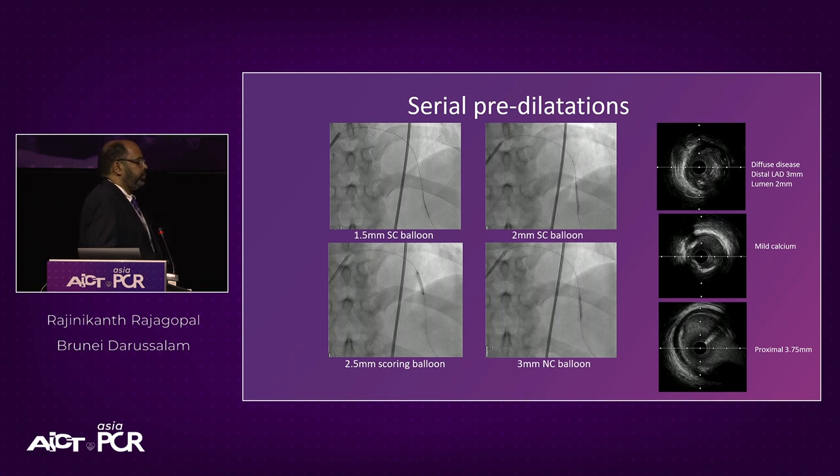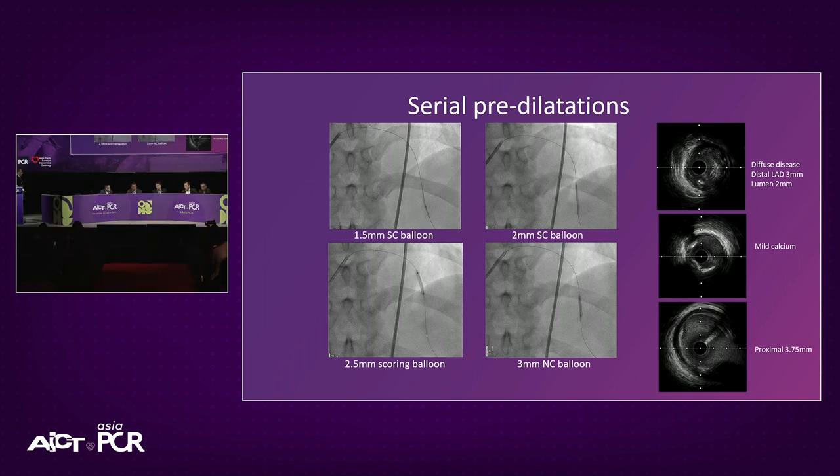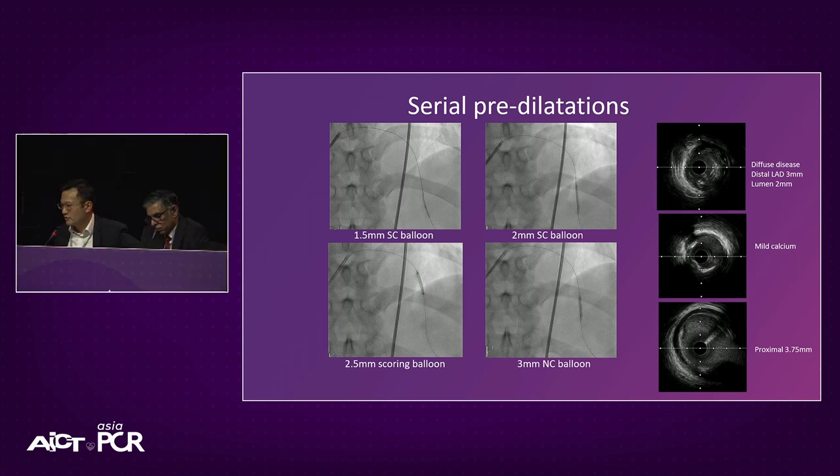I'll ask Chiang, if you have this imaging, you already pre-dilated some. What are the pointers towards saying this will work better with a stent versus DCB if the initial strategy was hybrid? Yeah, I think a lot of it will depend on how the balloon behaves on angio when you're pre-dilating. I think the role of imaging here would be to decide on a size for your balloon. So if you size the vessel already, then you use a one-to-one balloon to pre-dilate. And if the balloon is able to dilate well, then I think that means you've prepared the lesion well. If flow after that is still preserved, you don't have a lot of dissections, it looks okay, then maybe just a balloon approach might be good enough.